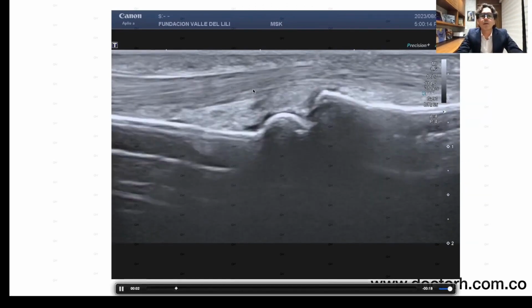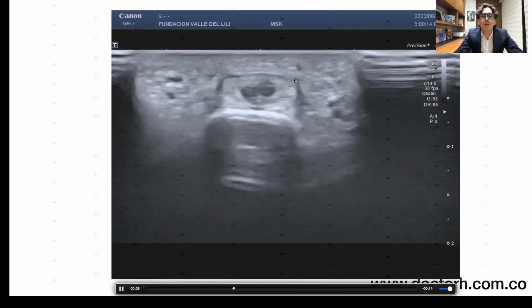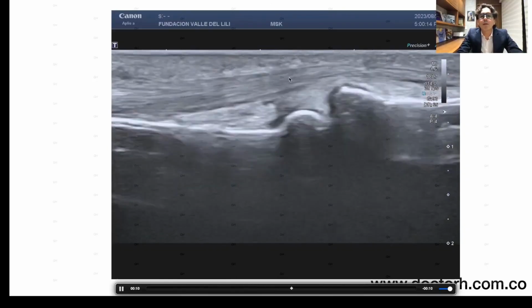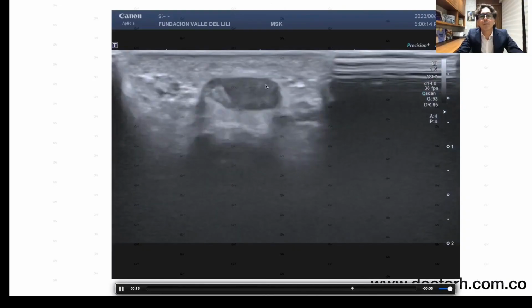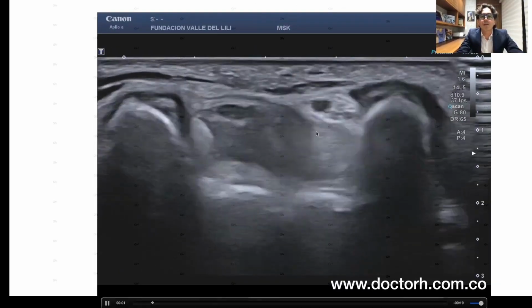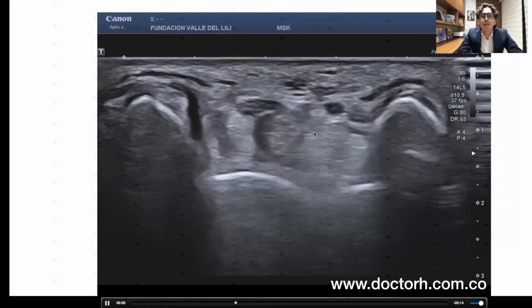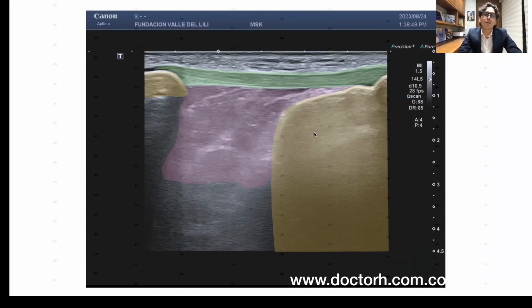Here's another example then, in transverse view, a laminar, well-organized pattern in longitudinal view, and in transverse, the salt and pepper pattern is very uniform. Again here, in our wrist, we identify the salt and pepper pattern in the tendons in the transverse view. Let's look at it in this other diagram, in a knee.